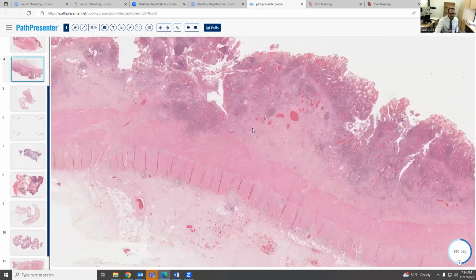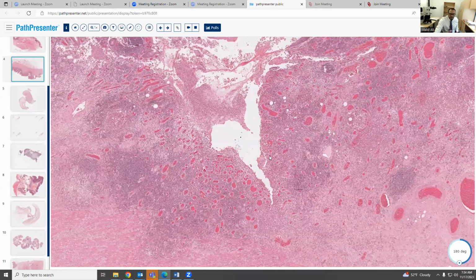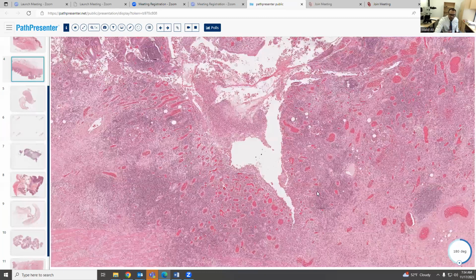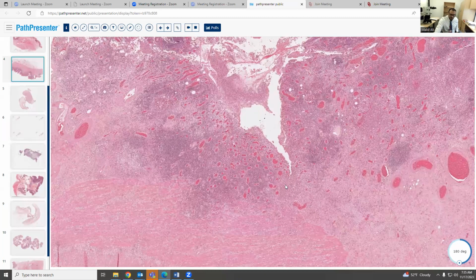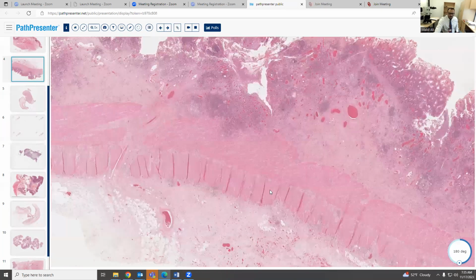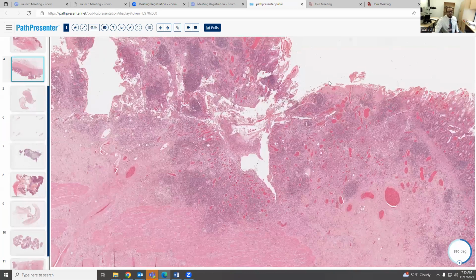Another thing that helps you tell this is Crohn's disease is what is called a deep fissure ulcer. There's an ulcer here. With an ulcer, we know that there is discontinuity of the normal epithelium, and it goes deep like here. And this deep fissure ulcer can go even deeper, even penetrate the whole thickness of the bowel, and then make a fistula. That's why Crohn's patients tend to have fistulas more often than ulcerative colitis patients.